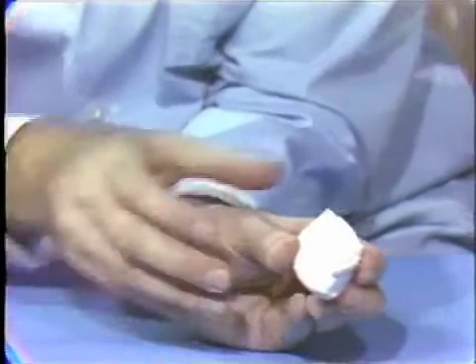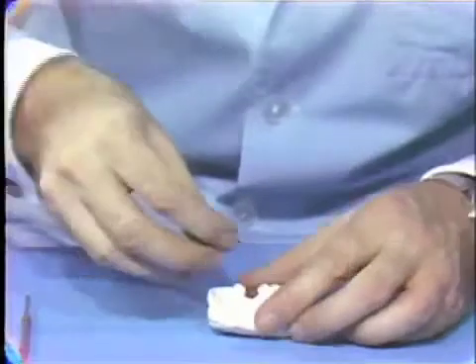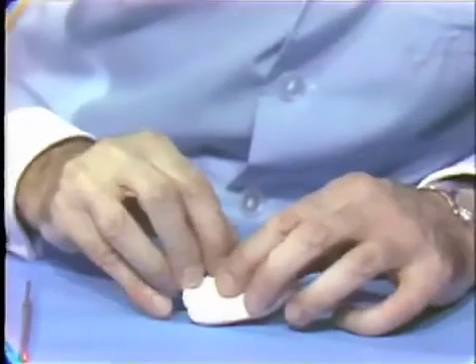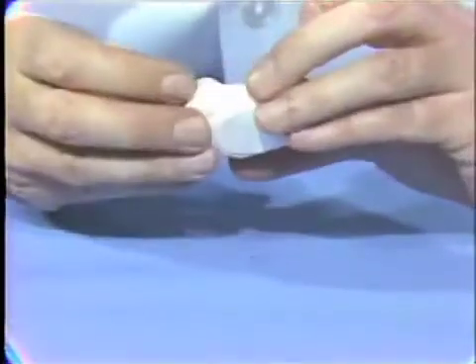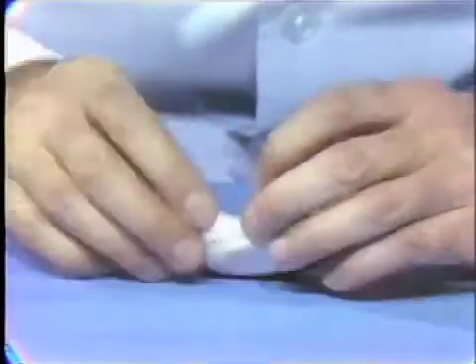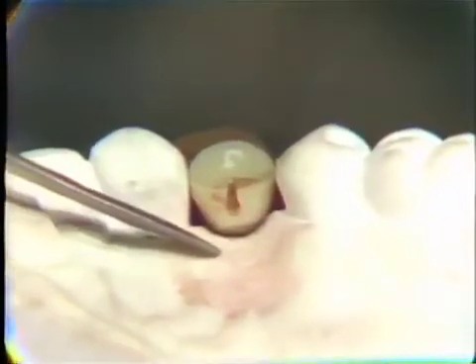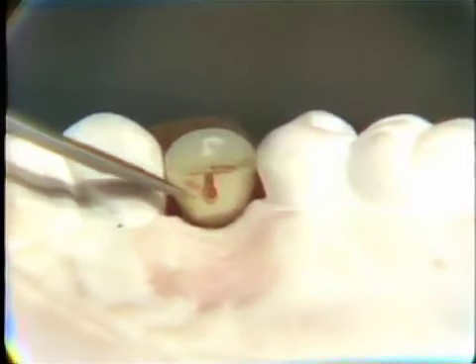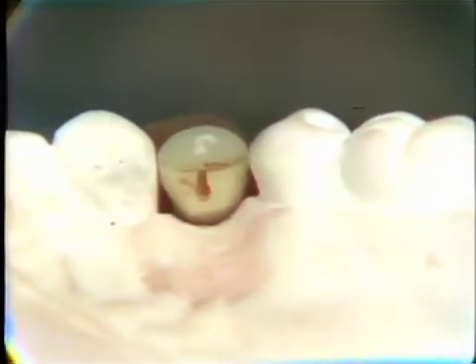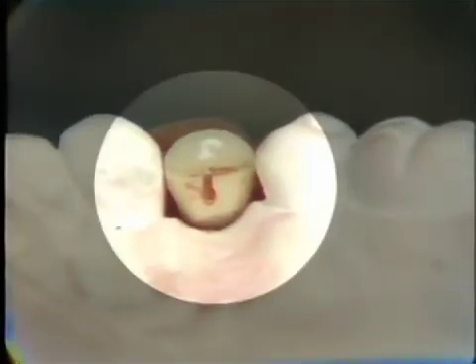Now, if you can get a close look at this, I'll just see if I can adjust this a little more easily so that you can take a look at that lingual surface. It's not too easy to do this on the TV camera, but I think that I can probably arrange it so that it will. Now, I think if you can look into that lingual surface there, and this is what you should do when you're doing your case, look in at the lingual surface there and notice that it does clear the mucosa there, that it is rounded to some degree, but I think you can see there's still some sharpish corners here and here. We're going to just grind those in order to round off this lingual part of the ridge lap, the part that does not touch the mucosa.